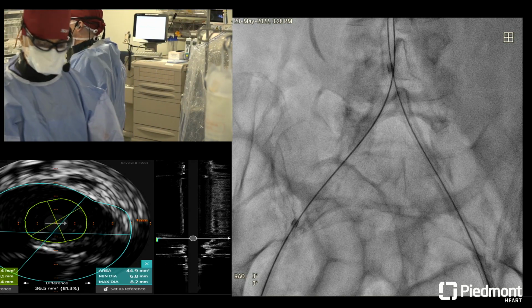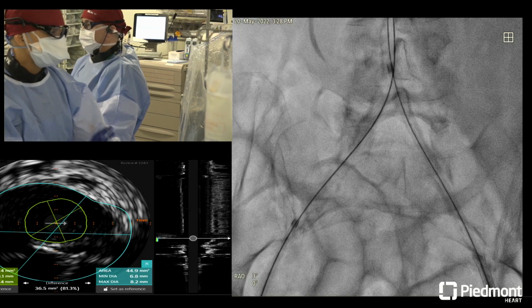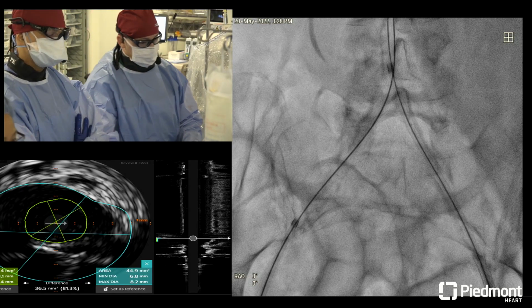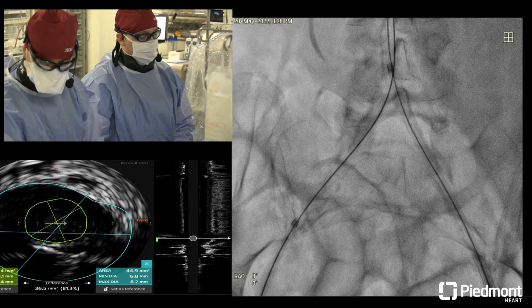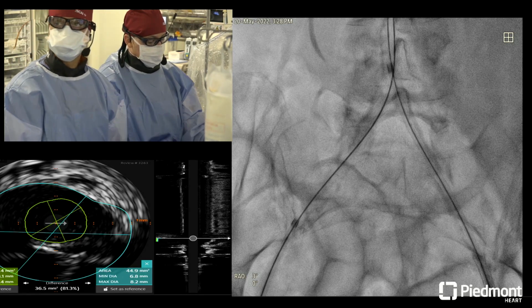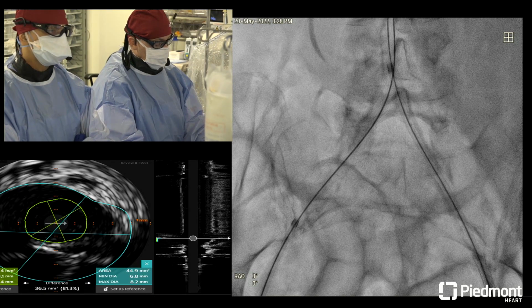For the audience, there's a nice article about fracture rates for covered stents in SCAI from March. Sahil Parikh passed it on, so check that out. It's a good review of 2 different types of covered stents that we brought up today. I want to ask a question: do you line this whole thing in covered stents, or do you go to self-expanding when you get midway down? No, I think probably just for the proximal common iliac. That's where it's probably most important.